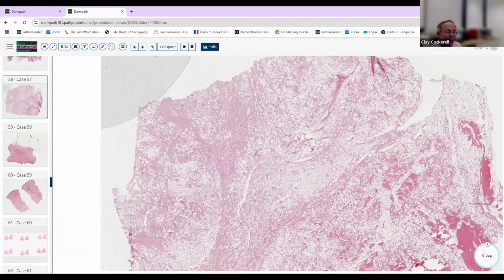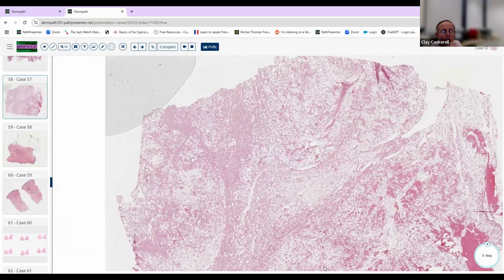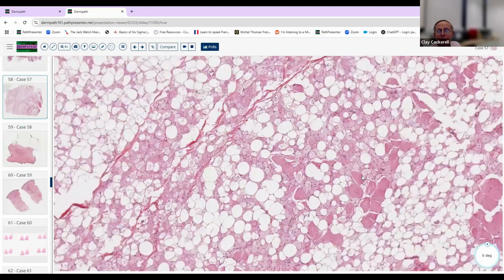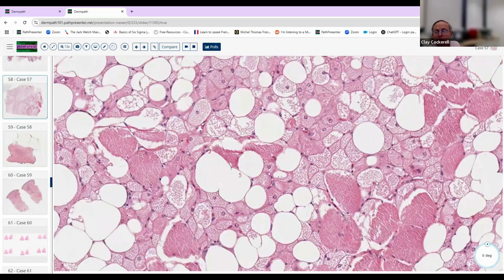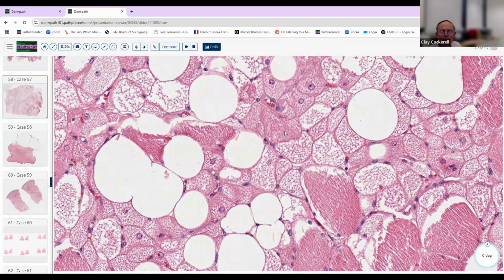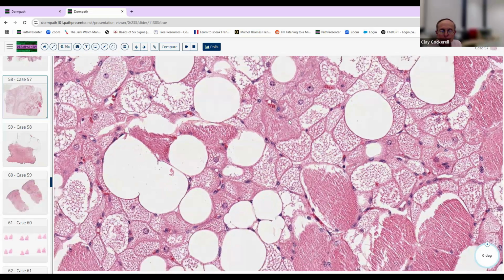This one we put on here, they had this on my boards many years ago. It's a benign neoplasm of fat, but notice it's got these cells that have these very characteristic structures to them. It looks almost a little bit like the granular cell tumor, but these look different. These are not little granules. These are small little foci of mitochondria within the fat cell. So remember this. You have to memorize kind of what it looks like and be able to recognize this. This is brown fat. And this is an example of a hibernoma.